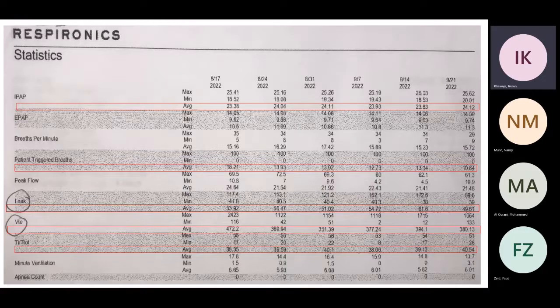Okay. But in neuromuscular disease, you need to keep the patient trigger on the lower side, correct? That's the COPD patient. Correct. And how does resting the diaphragm, you brought up this?